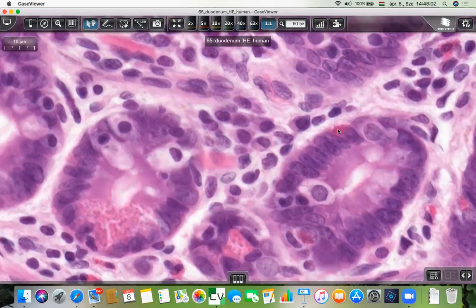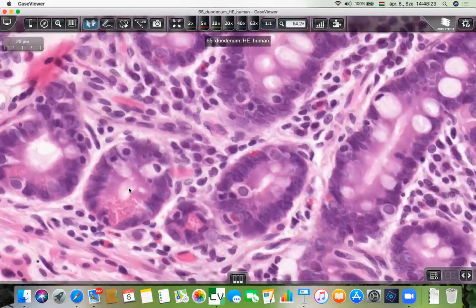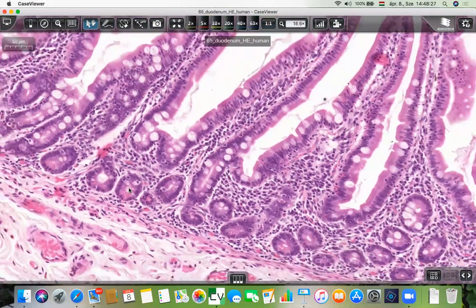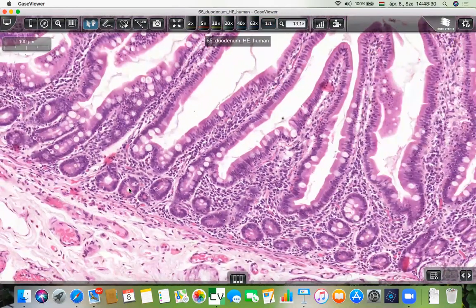And beside them, the simple columnar enterocytes, goblet cells, Paneth cells, and enteroendocrine cells, we can sometimes find undifferentiated cells. They are the sources of the different cell types in the crypts of Lieberkühn. Yeah, they were the typical components of the lamina propria.